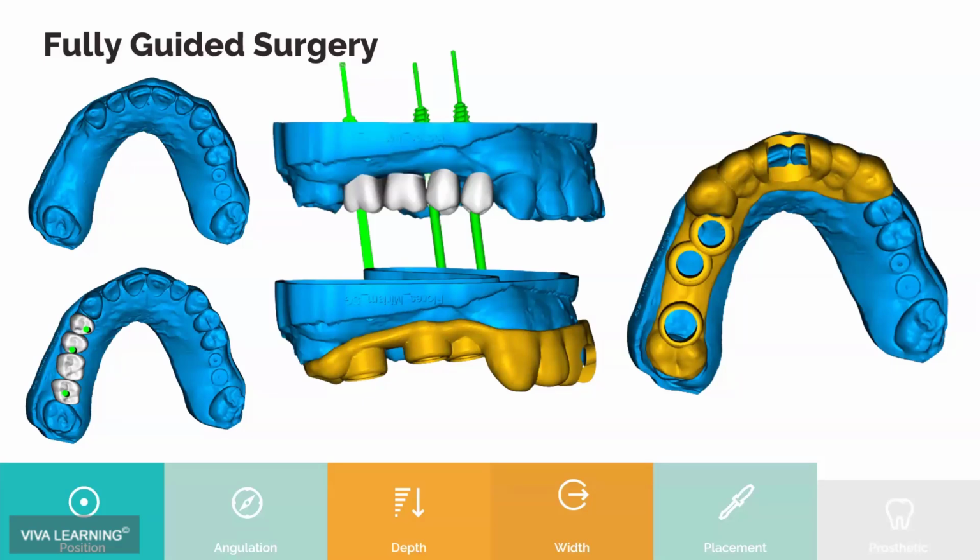You should not be able to draw a straight line between all 3, because then the axis of rotation and excursive movements is all on one axis. So offsetting that middle implant by just a little bit allows the forces to be a little bit friendlier when the patient is actually chewing and functioning on this implant. I think to this date might be the only case I've had like this that happens to have 4 teeth, but it's kind of an interesting thing to look at.